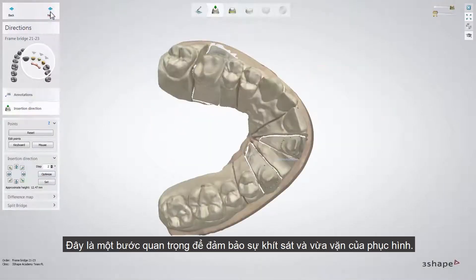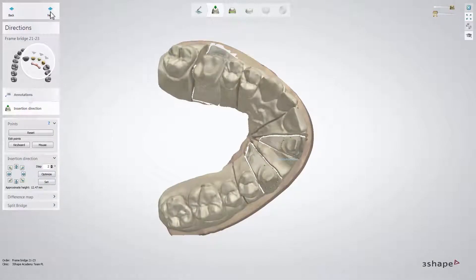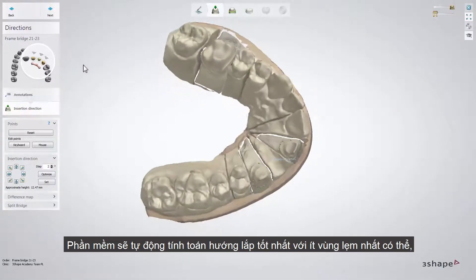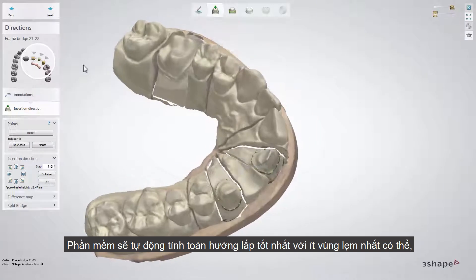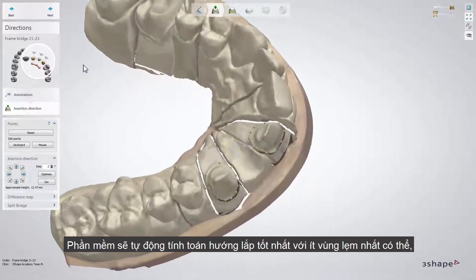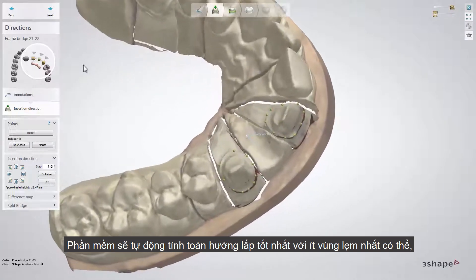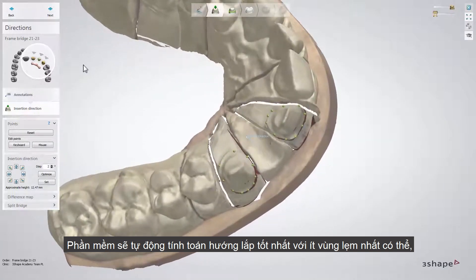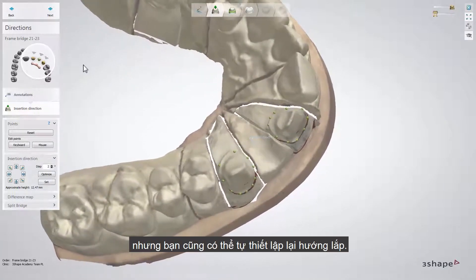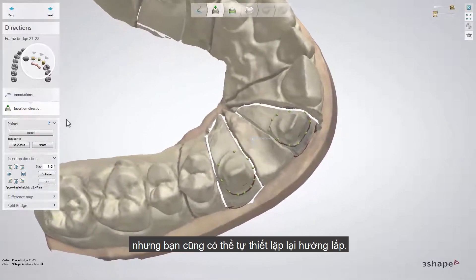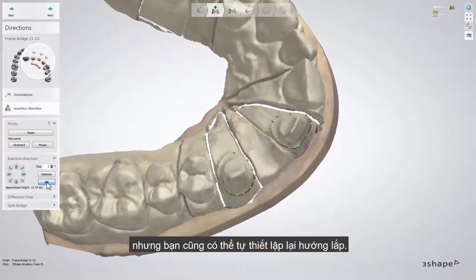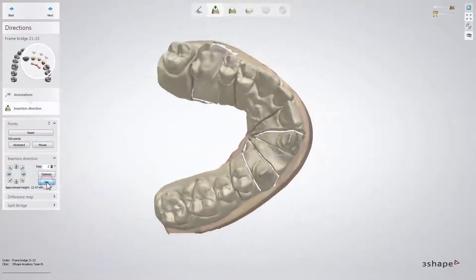This is an important step that ensures the correct fit and seal of the restoration. The software automatically calculates the best insertion direction with the least amount of undercuts, but you are still able to set the insertion direction manually.